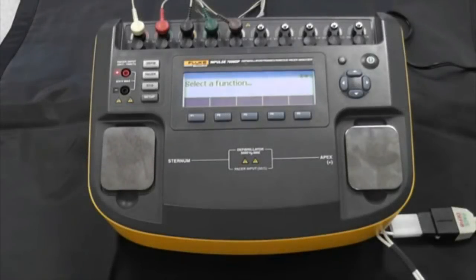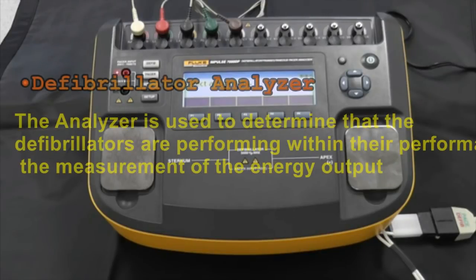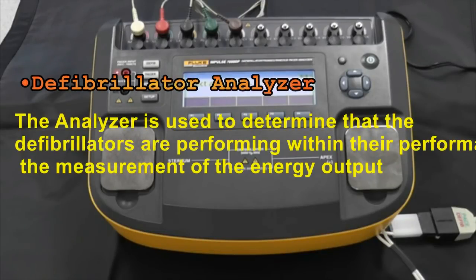I want to talk to you about the Impulse 7000 defibrillator and pacemaker analyzer from Fluke Biomedical. This is the Impulse 7000 — you can see we have it all set up with some ECG leads connected to it. This unit is designed for testing any defibrillator, including AEDs, and the transcutaneous temporary pacemakers that are integrated into defibrillators.